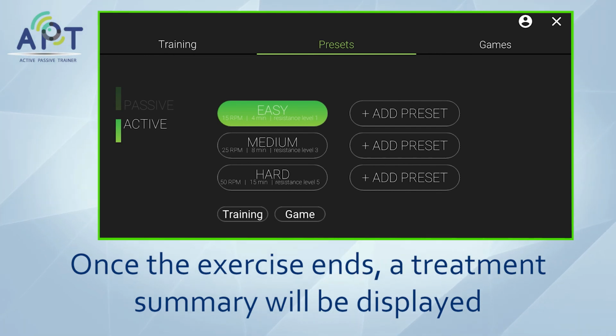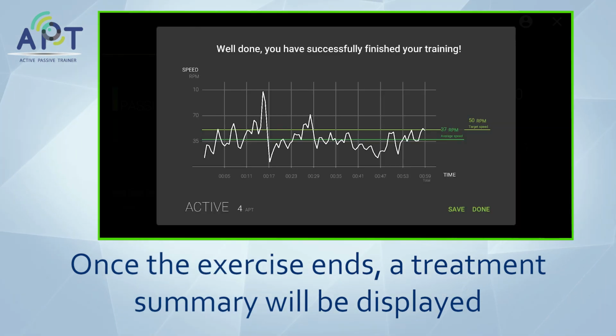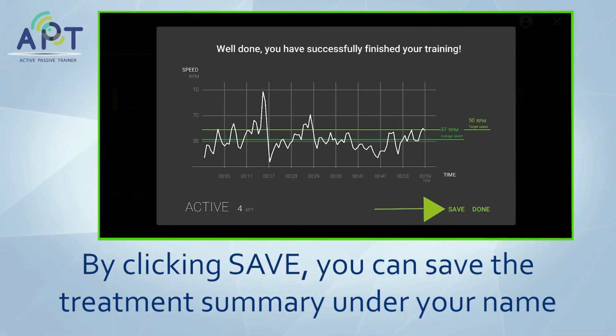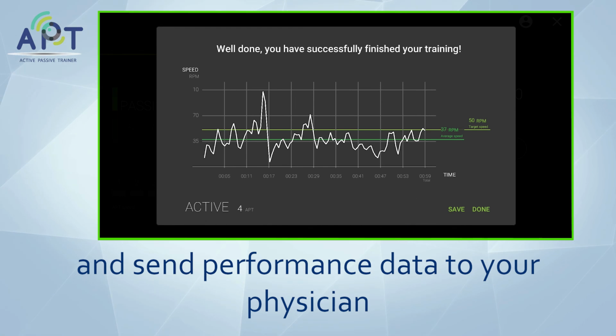Once the exercise ends, a treatment summary will be displayed with an analysis of your performance throughout the exercise. By clicking Save, you can save the treatment summary under your name and send performance data to your physician.